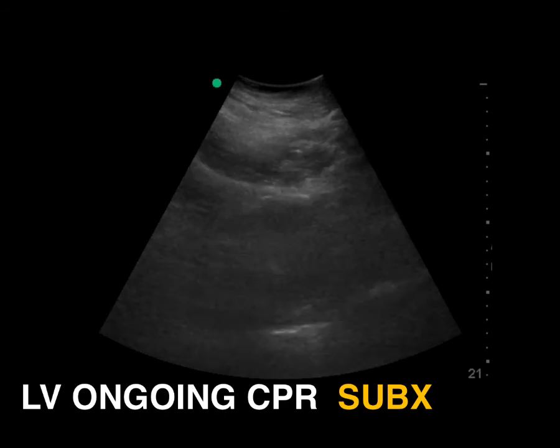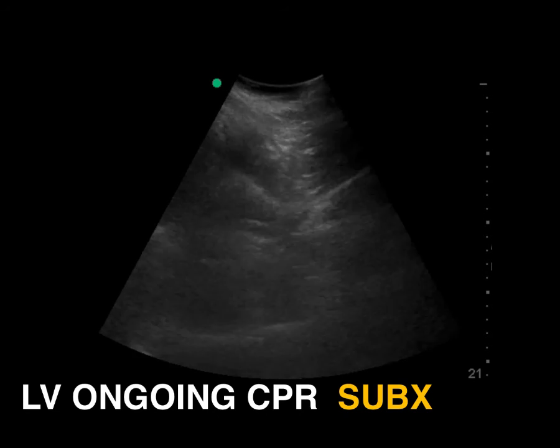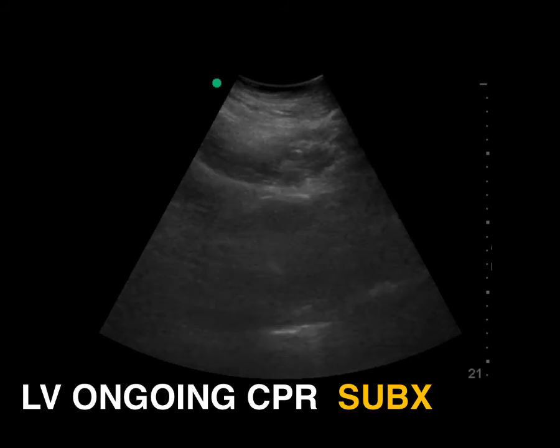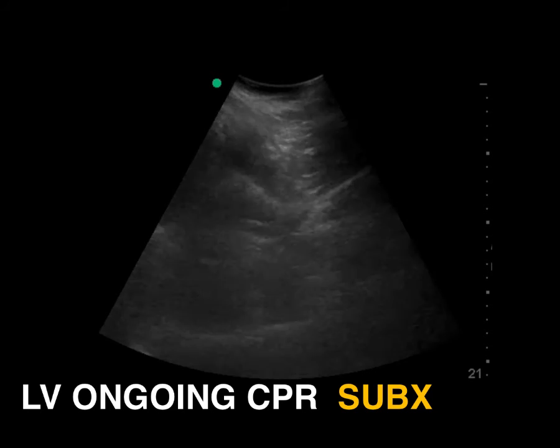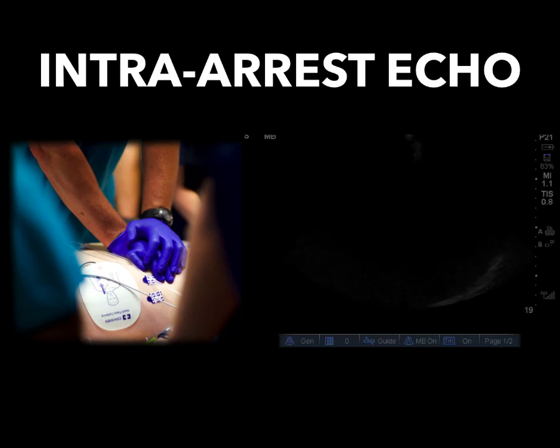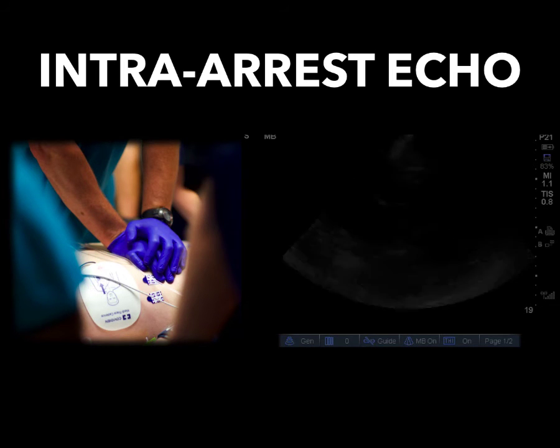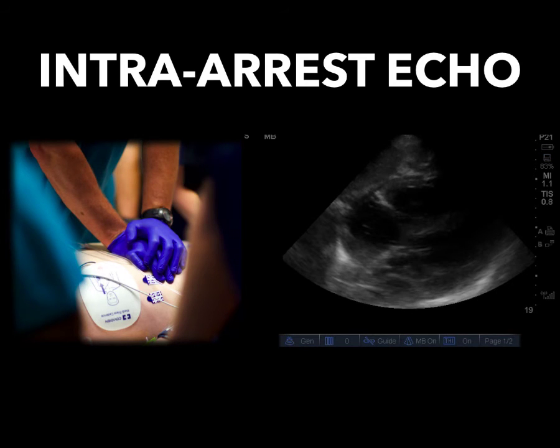Again, this is not validated. This is conceptual. This is supported by the observations using transesophageal echo on the same patients. So again, this is not something you should run and apply, but this is something that you should probably start looking at and considering for your next resuscitation. So in general, you could say we could use point of care ultrasound and echo to assess whether the compression is actually happening where it should be happening.